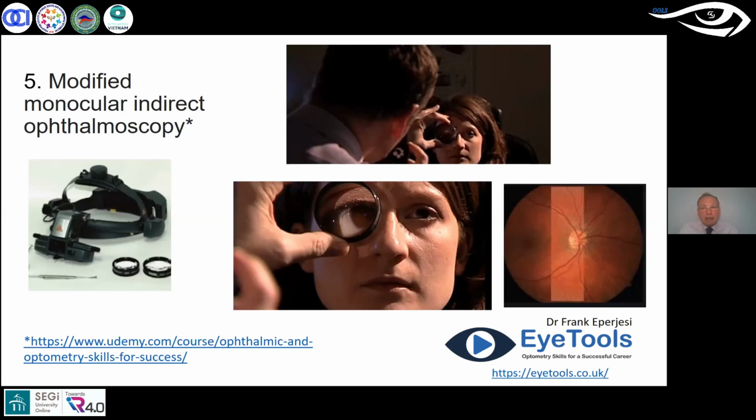What's in the light? You said before there was something interesting in the light. What's in the light? And no matter what I have asked them to do, to look in the distance, to get their parents to sit across the room and wave at them, I can't see the optic nerve head with my normal direct ophthalmoscope. But with this technique, using an indirect lens and my direct ophthalmoscope, and I'm sat back at about 18 centimeters.